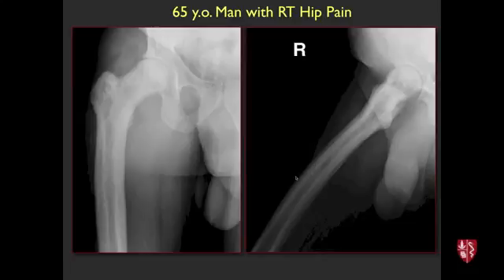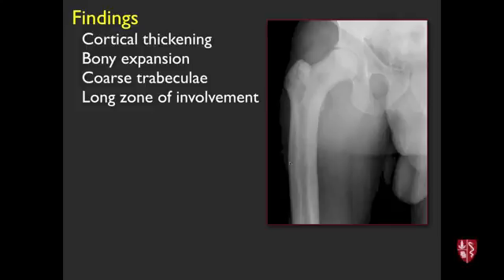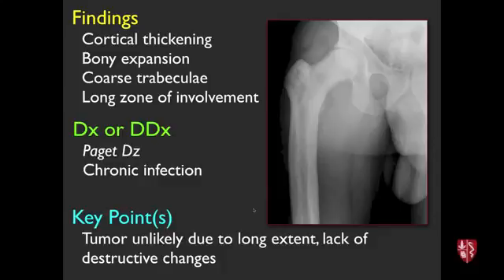Next case, 65-year-old man with right hip pain. We see cortical thickening along the femur — very thick cortex, probably overall expanded — coarse trabeculae, and a long zone of involvement covering almost the whole bone shown. Paget disease is the top diagnosis; potentially chronic infection as well. A tumor would be unlikely given the extremely long extent of involvement, and there's no destructive change suggesting a definitely aggressive lesion.